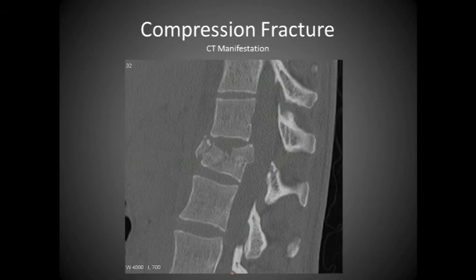Here is a compression fracture. Very difficult to distinguish between it and a burst fracture, or at least on this one. We have anterior fragmentation and some posterior fragmentation as well. We have a line running like this and this.